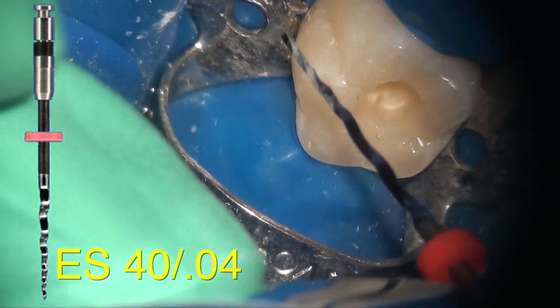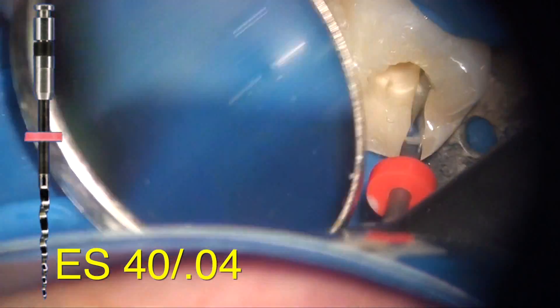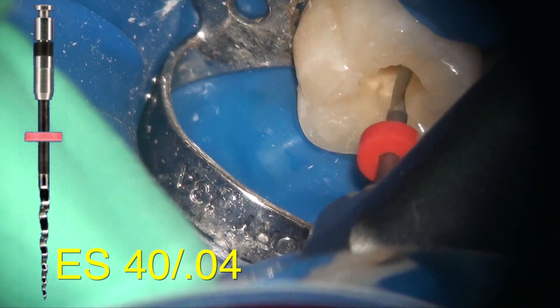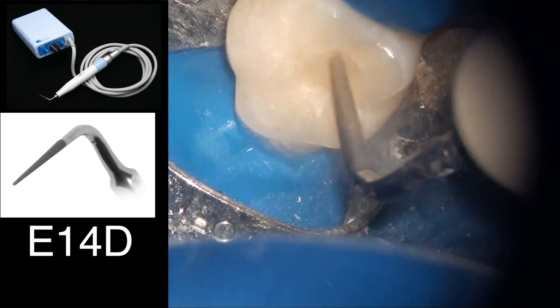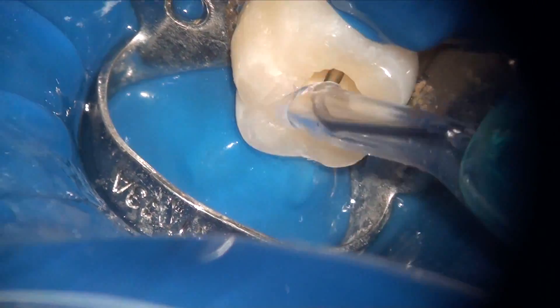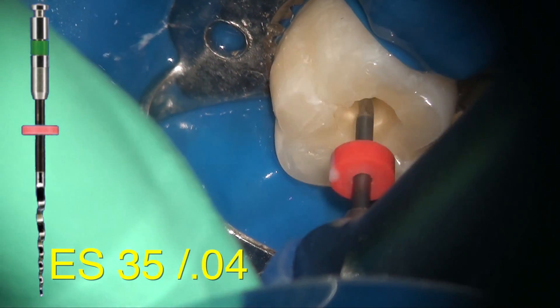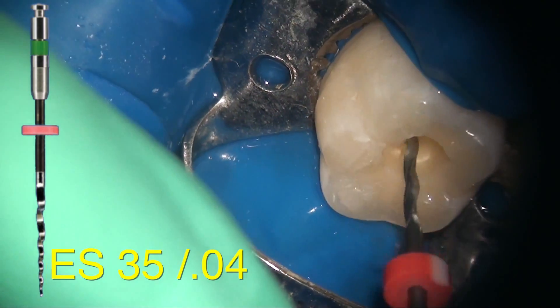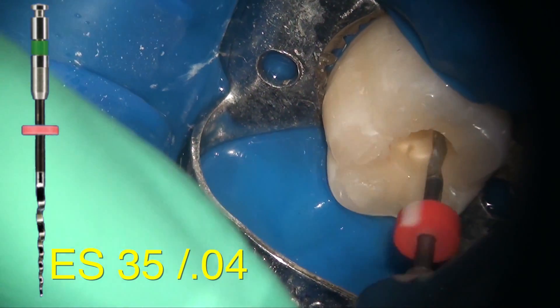It's important to wipe the flutes clean. You do two passes with each file in each canal. I'm doing the mesiolingual: one, two, three — out — and my assistant wipes it with an alcohol gauze — then one, two, three — wipe. Now we're done with the size 40 and moving one size down. I'm using the ultrasonic with water to irrigate debris from the size 40, and now adding a little bit of EDTA to facilitate instrumentation. Moving to a size 35: one, two, three — out — wipe — in each canal.